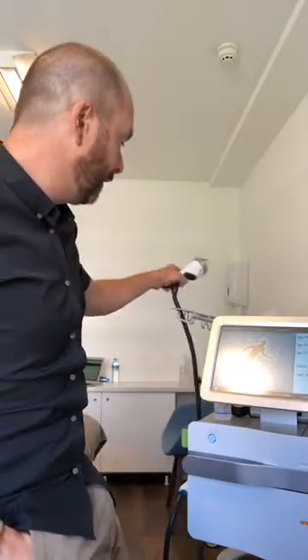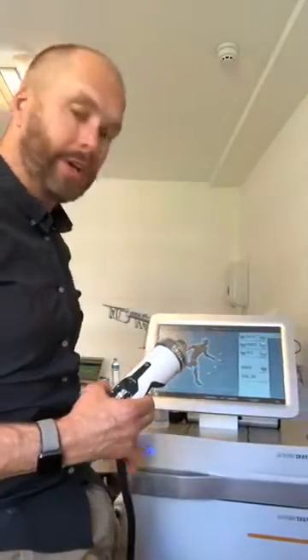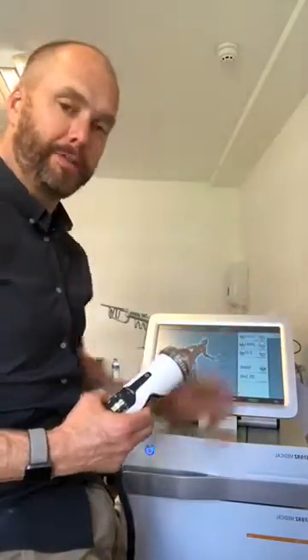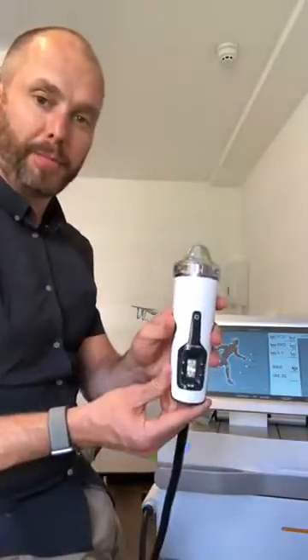One of the things we're going to look at here is a focused shockwave device, and we're looking at this primarily for the treatment of musculoskeletal problems. This machine comes with a screen that's much bigger than perhaps the other one and has a bunch of features on it. But first of all, let's just look at the handpiece.